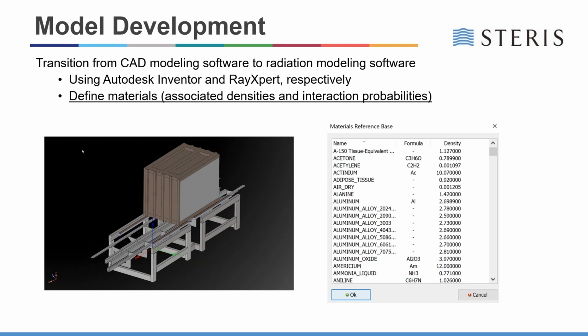There is a feature to create your own materials, though, in order to provide you the flexibility for variations of materials or for materials that aren't defined in this software database, which does come up quite frequently too. So being able to have the capability to save those materials in a reference database is beneficial, because then you're allowed to reuse them with ease.